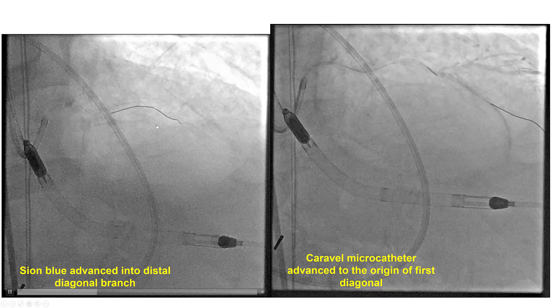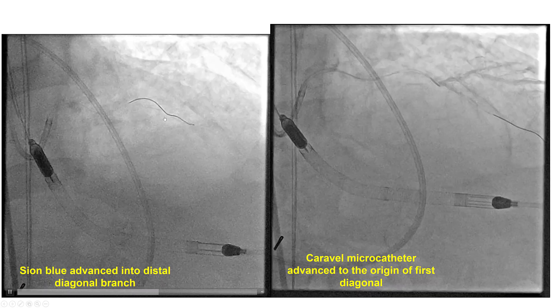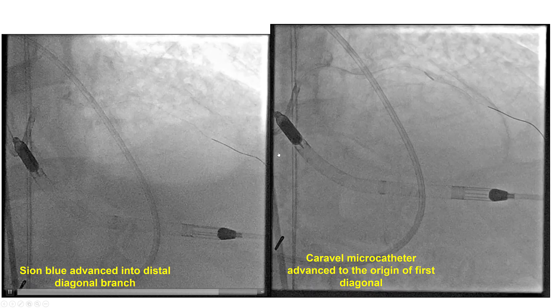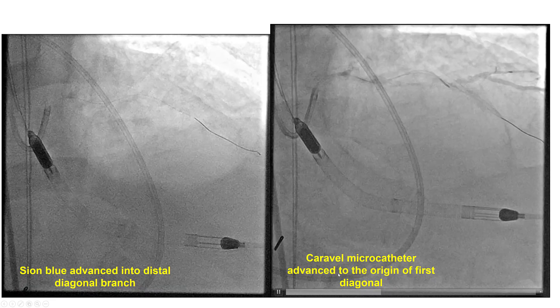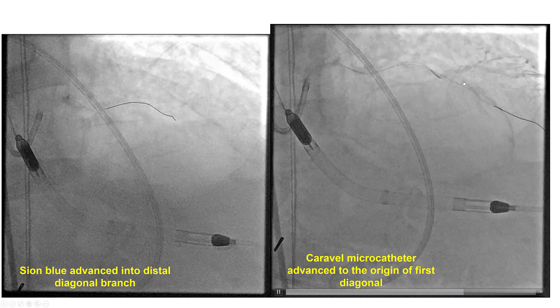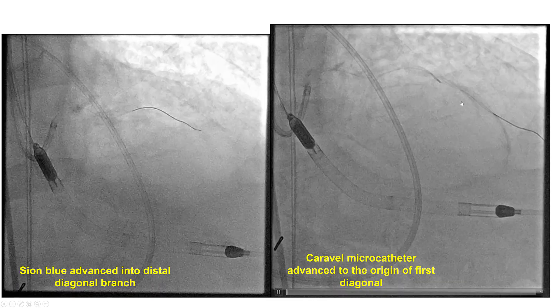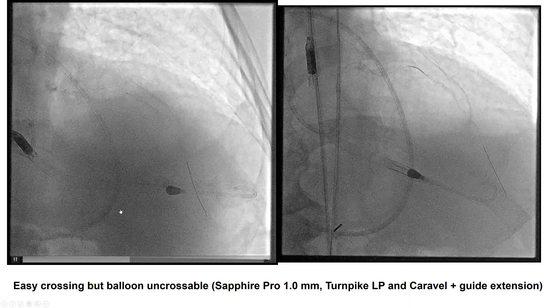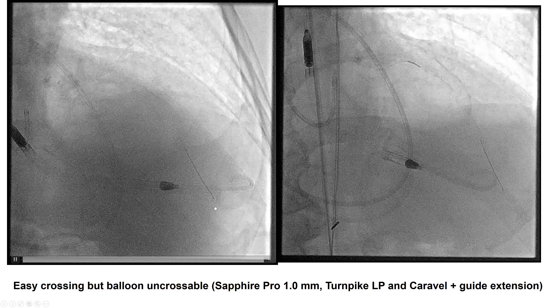To our surprise, we were able to advance a workhorse wire into the diagonal branch, and then, getting the Caravel microcatheter right at the proximal cap, we were then able to easily advance a Fielder XT wire into the distal LAD.